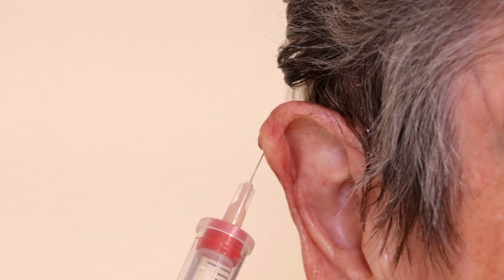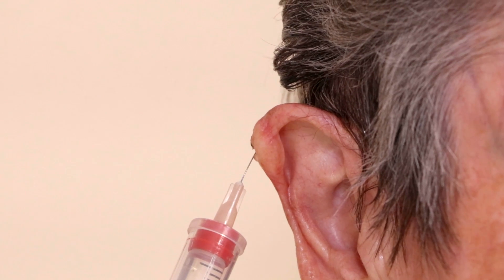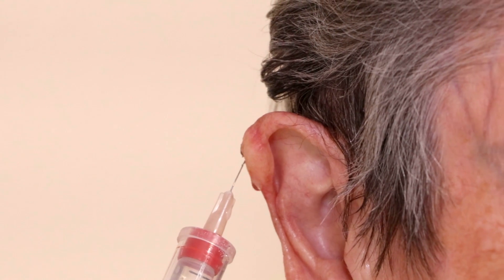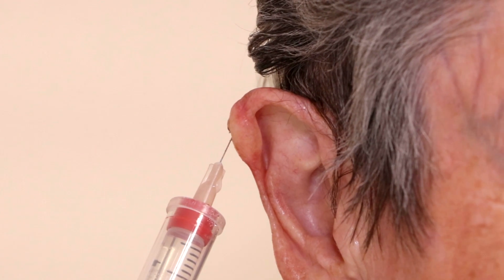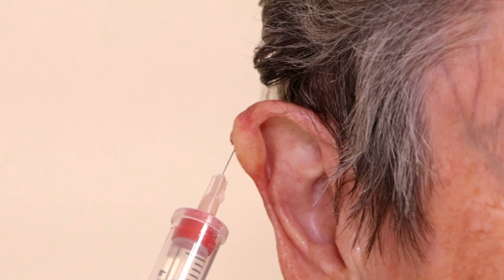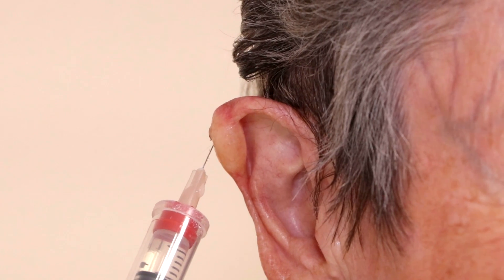One thing that's nice about what's going on now is it's making it really fat — it's putting a lot of fluid behind it, and that helps to stick it out away from the rest of the ear so we can shave it off. Are you hurting? No, it's fine. I hardly feel it, with the anesthetic spreading it out.